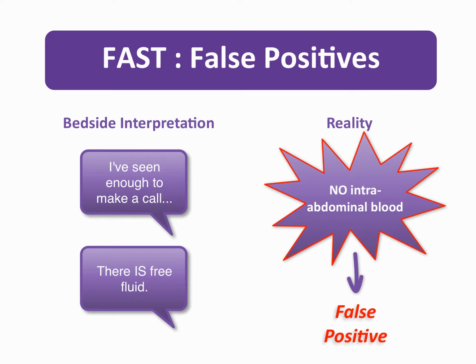In rare cases, a false positive in an unstable patient may lead to a laparotomy searching for an abdominal bleed, when in fact the source of the patient's instability is something else. Obviously, this may lead to a negative laparotomy and delay to appropriate treatment. As such, it is important to familiarize yourself with sources of false positive studies.